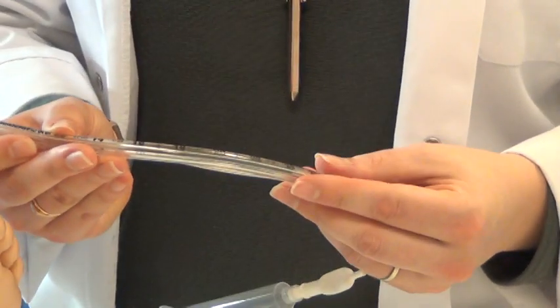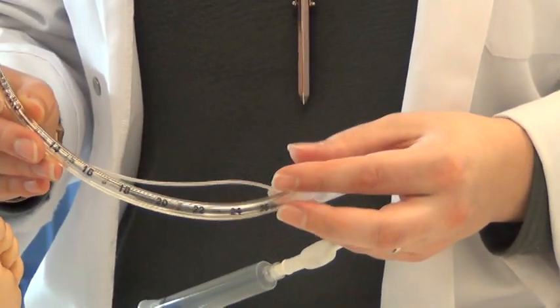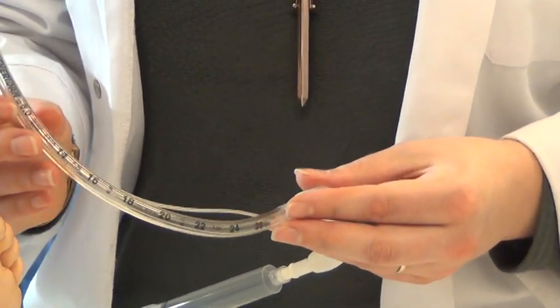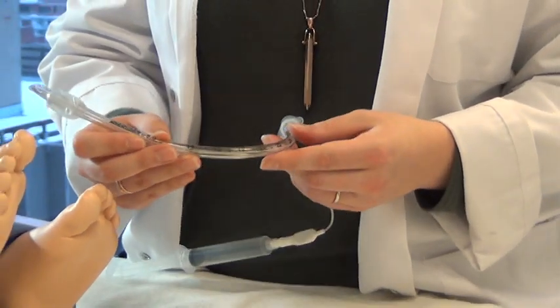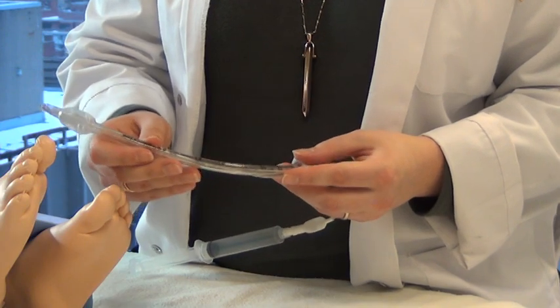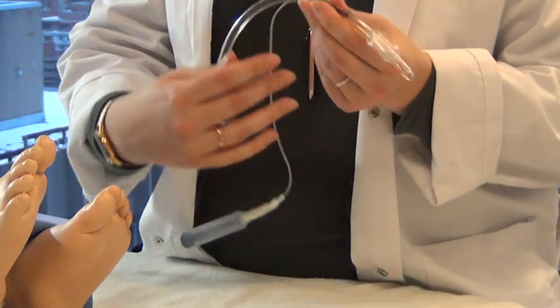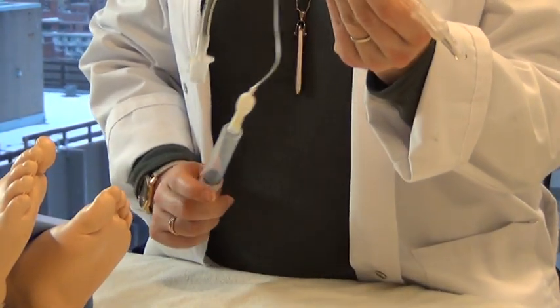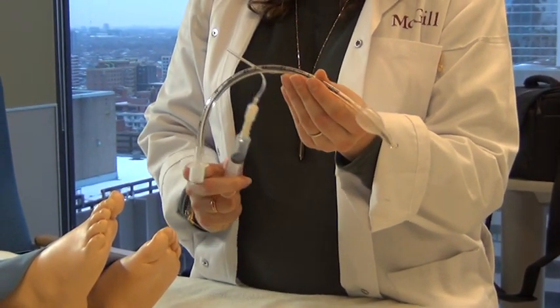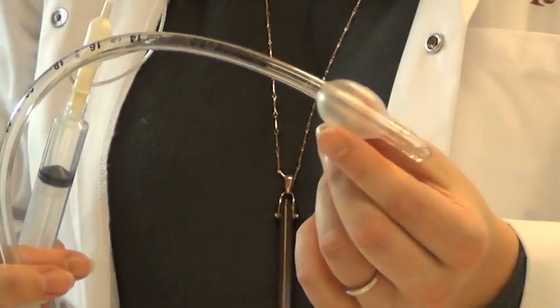So these endotracheal tubes are usually taped to our patient's face through different methods, sometimes it's just some tape, other times it's ribbon, and we have also fancier methods of ensuring that the tube does not move from the patient's lungs, essentially. At the tip of this tube, there is a balloon here. Once this tube is inserted into our patient's airway, we will inflate this balloon, and the balloon will stay inflated as they are receiving mechanical ventilation.